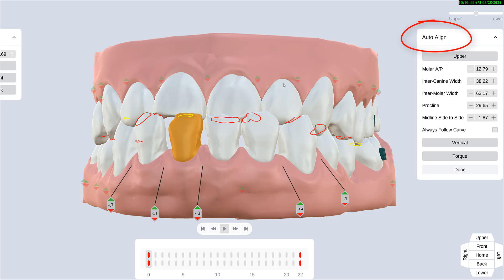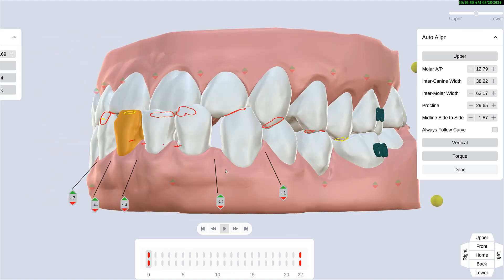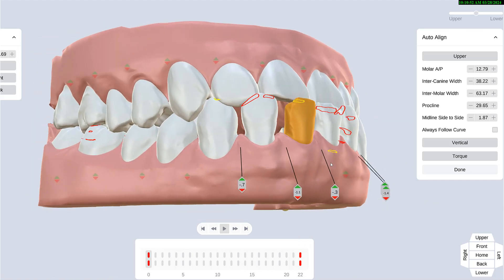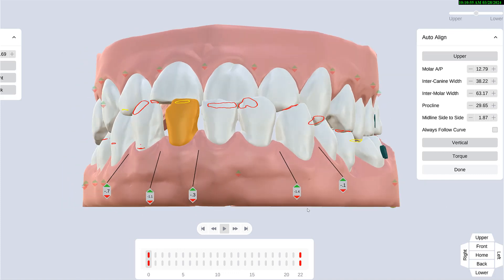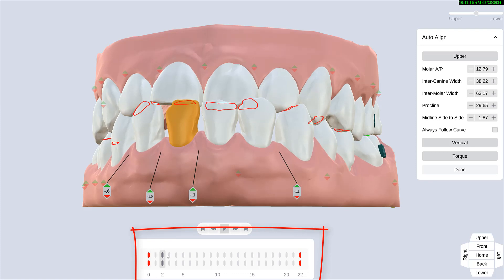So what does that mean? It means that the computer will take this malocclusion right here and try its best to resolve it automatically, based on artificial intelligence or machine learning, and it will help and speed up the processes as these technologies are getting more sophisticated — but it's already pretty good.